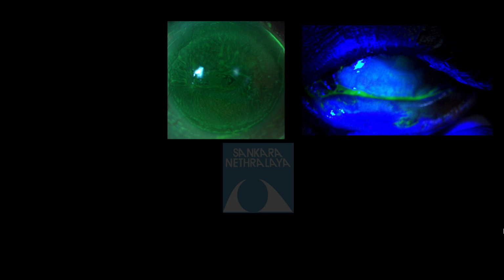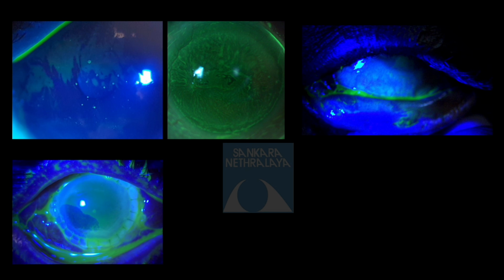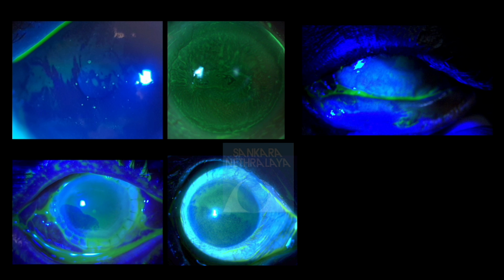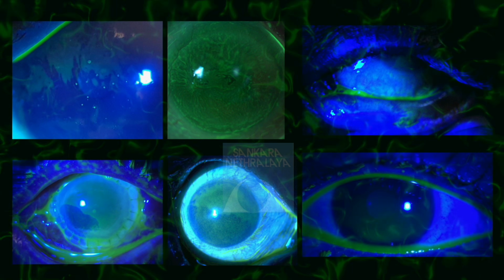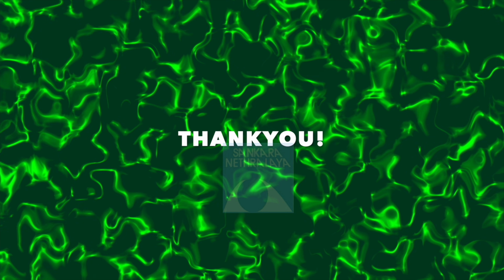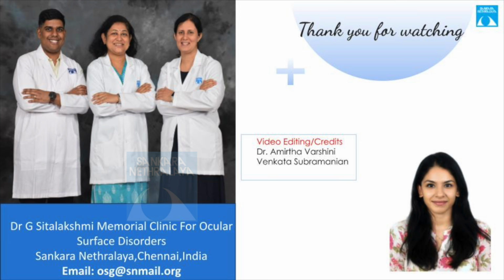In conclusion, fluorescein staining is more than just a diagnostic tool. It acts like a magic wand for the clinician, revealing what the naked eye cannot see. From subtle tear film instability to epithelial defects, keratinization and infections, it highlights the hidden disruptions on the ocular surface. This simple dye brings clarity to complexity, illuminating the path to precise, targeted care.